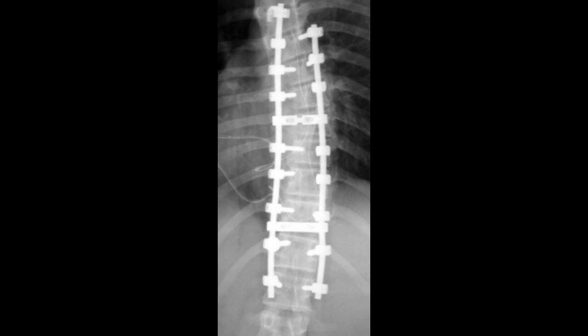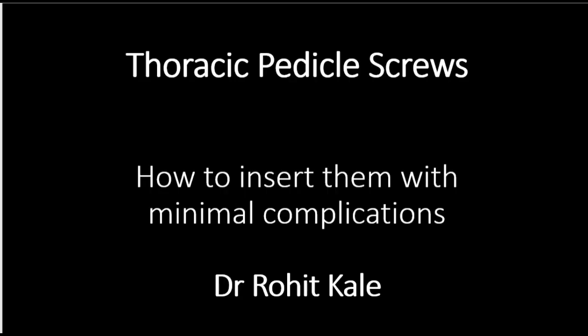Thoracic pedicle screws is one of the enigmas which haunt every spine surgeon. How to insert them with minimal complications is what we are going to discuss today.